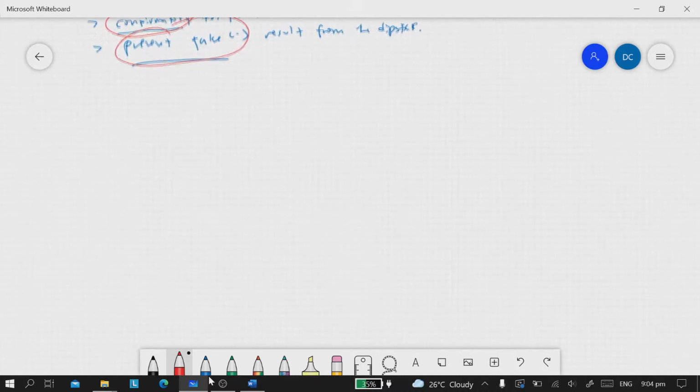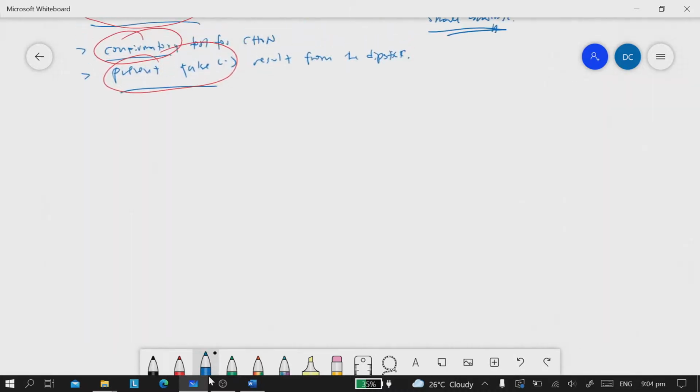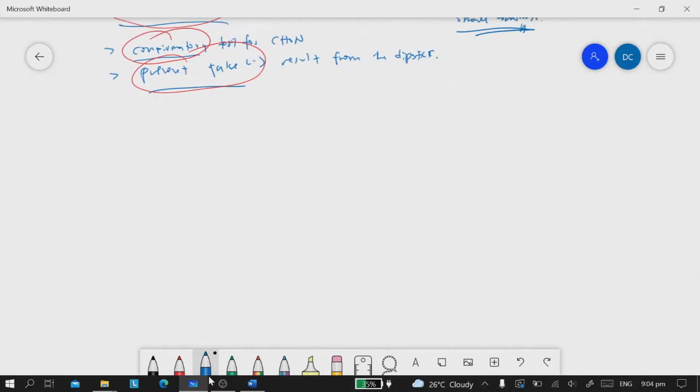All right. So let us review how we will do the SSA manually. Usually, in clean mic, these are the first activities, I believe, for the laboratory portion. But since you haven't done face to face yet, sayang. Hopefully, you can make it up soon.